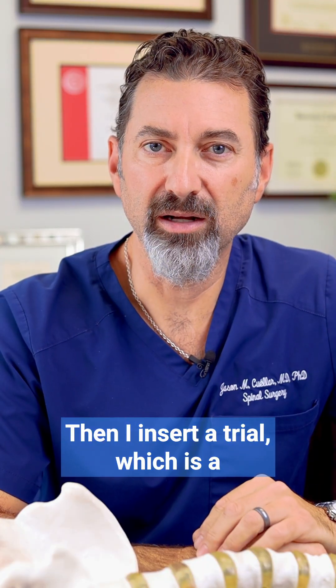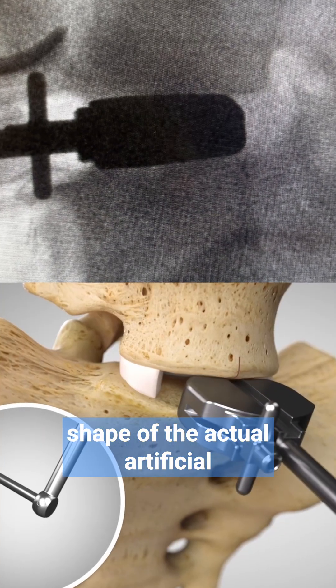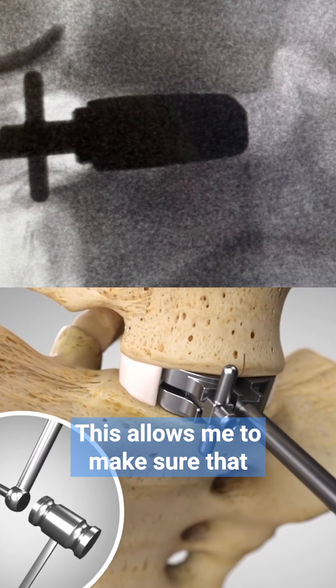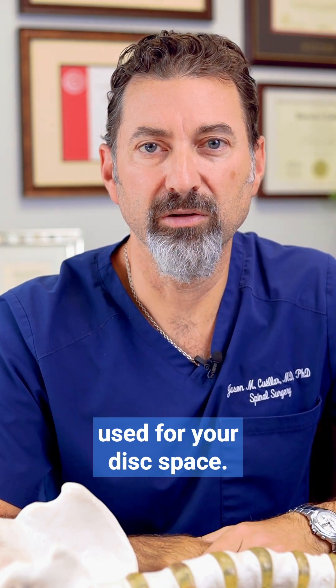Then I insert a trial, which is a metal device of similar shape to the actual artificial disc implant. This allows me to make sure that the proper size is used for your disc space.